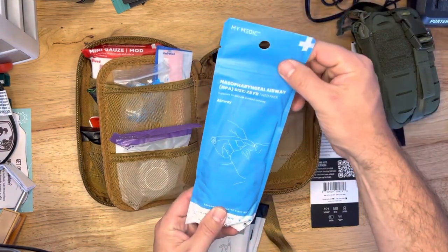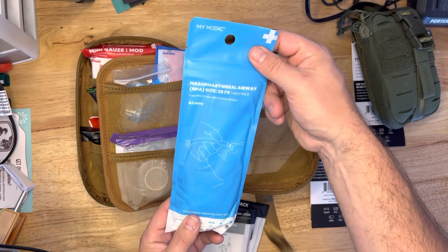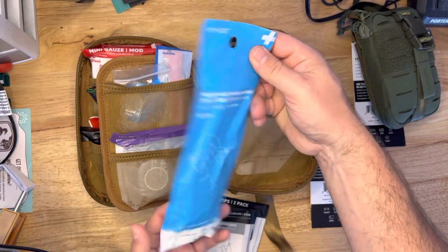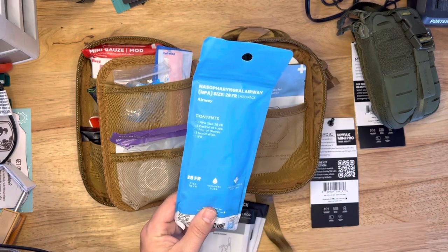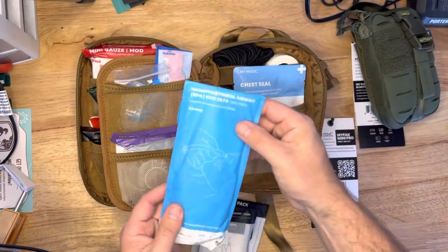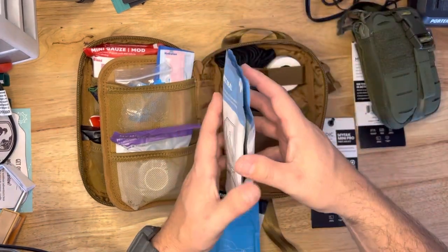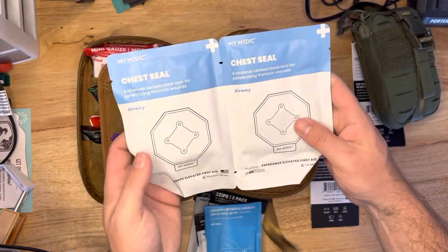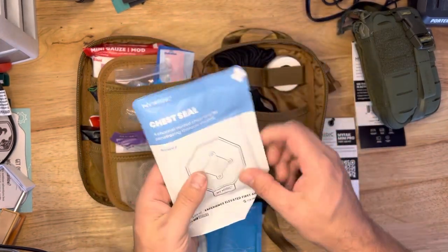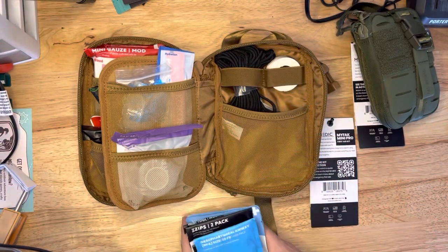We even got a nasopharyngeal airway — size 28 — contains one of those, plus lube, gloves, hand wipe. Don't do these unless you know how to do them, though. Chest seals — big chest seals. These are bigger — they've changed these a little bit. There's some new branding on some of their packaging. These chest seals look a little larger too than the ones I have currently from MyMedic.